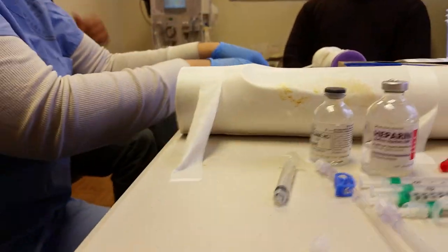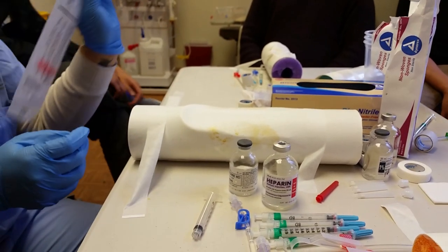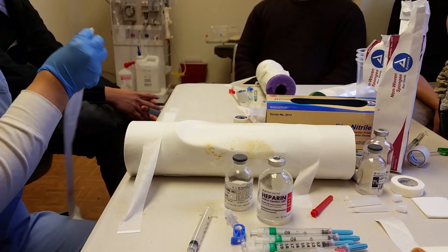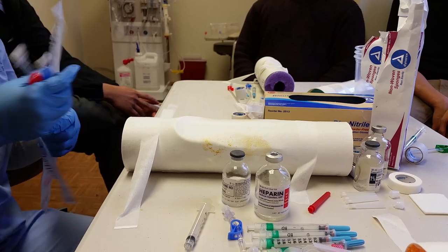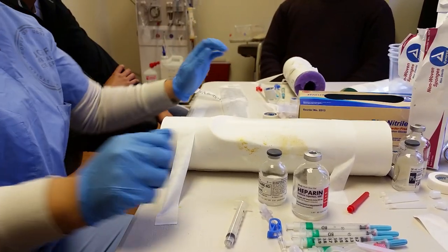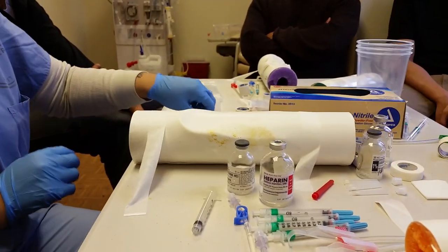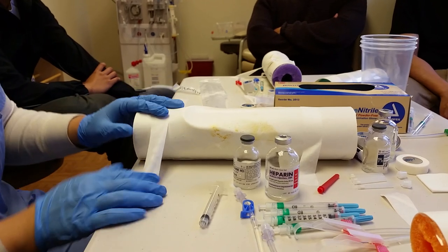You've got all your supplies ready. Double check the order — patient is on 17 gauge needles. It's a doctor's order, like everything basically is a doctor's order, so you just follow the doctor's order.